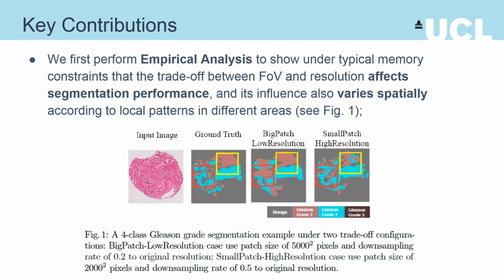Therefore, the first key contribution of this work is that we perform empirical analysis to show that under typical memory constraints, the trade-off between the field of view and resolution affects segmentation performance. And more importantly, its influence also varies spatially according to local patterns in different areas.